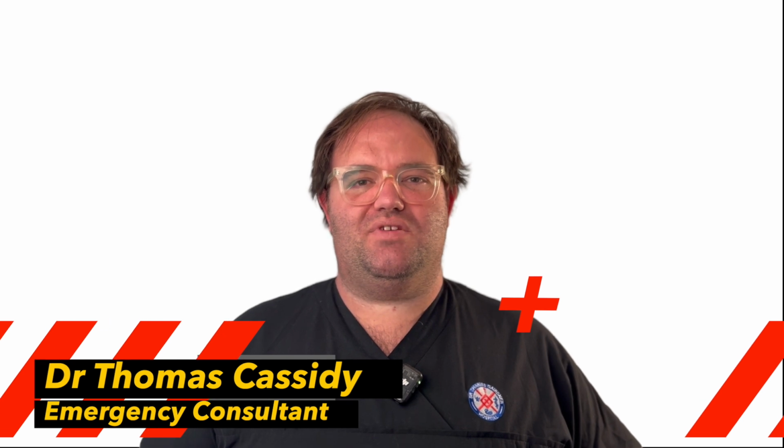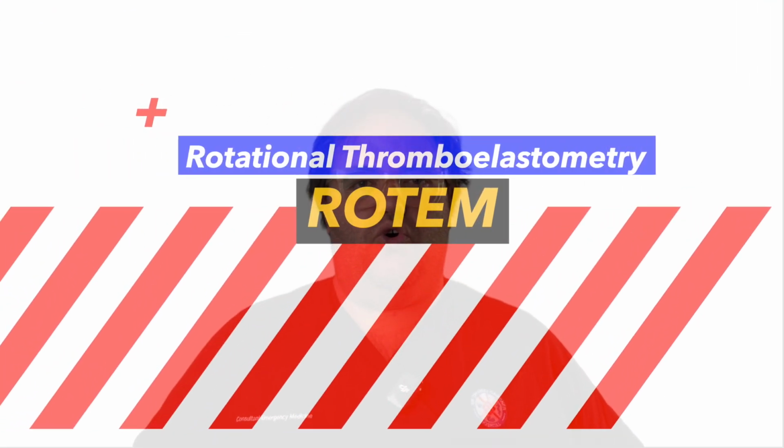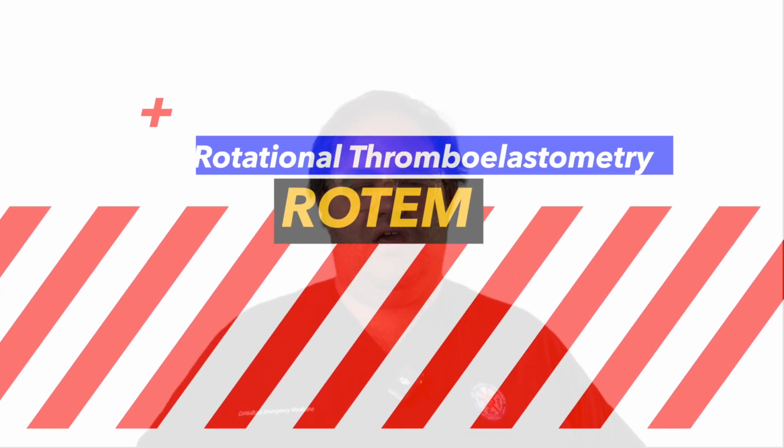My name is Dr. Thomas Cassidy and I'm an emergency physician at St Charles Gardner Hospital in Perth, Western Australia. Today I'm going to walk you through the basics of emergency rotational thromboelastometry, or ROTEM, interpretation. This is a crucial skill for managing bleeding patients in acute settings.